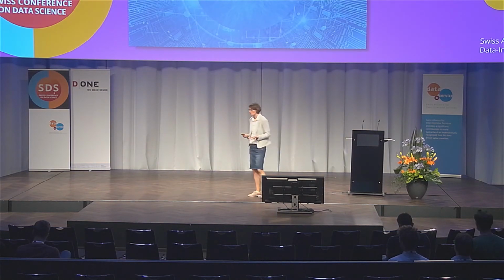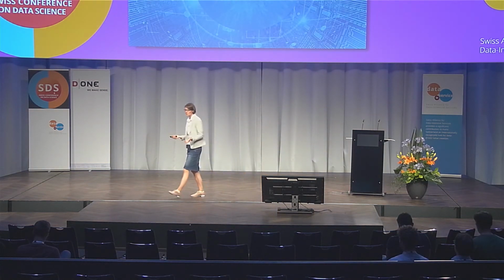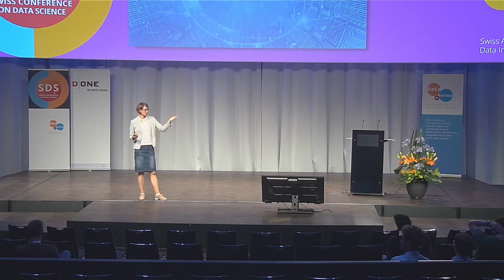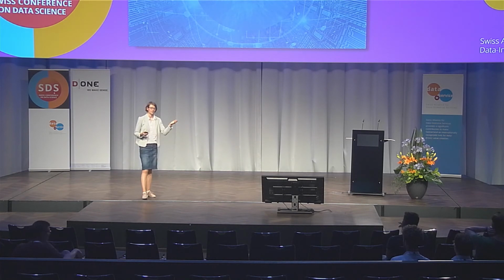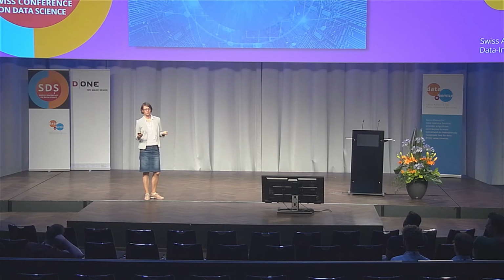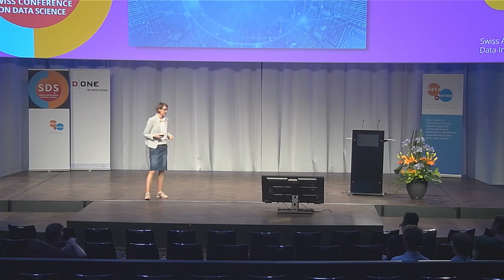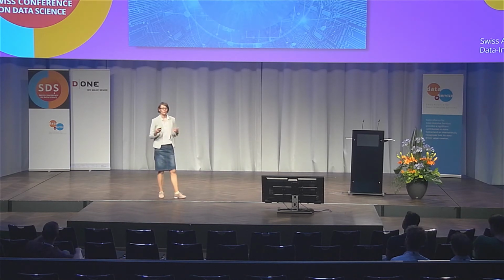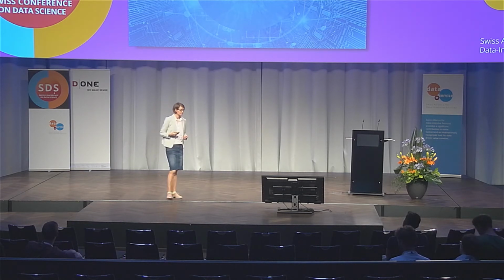To conclude, what were our learnings? One thing is that it's very challenging with one CNN to cover the full input range of data. That was also already mentioned previously. We had training data from 2 different instruments. Now, if a third instrument comes, this will be a different challenge again. And there were different sizes of image input data which we had to incorporate.